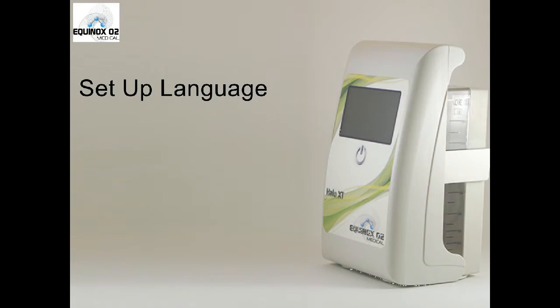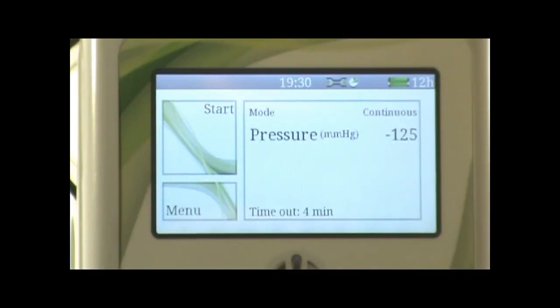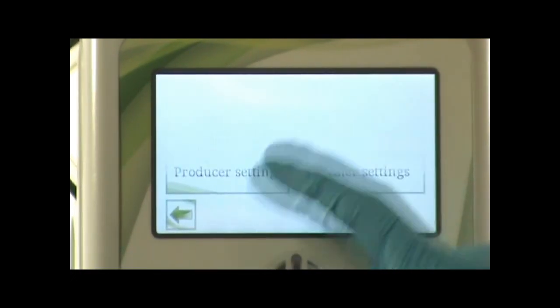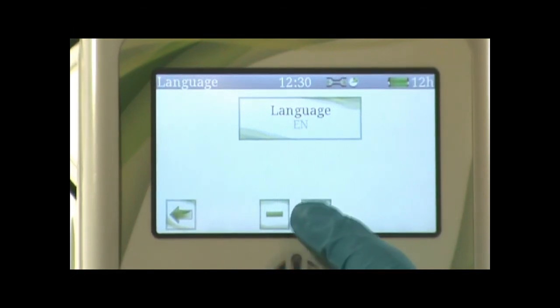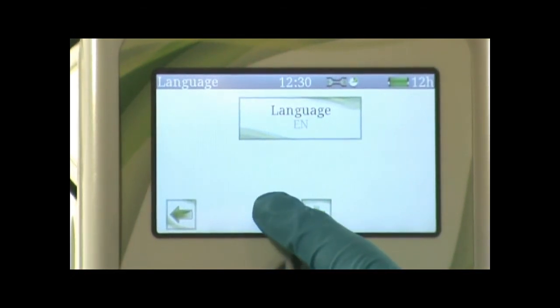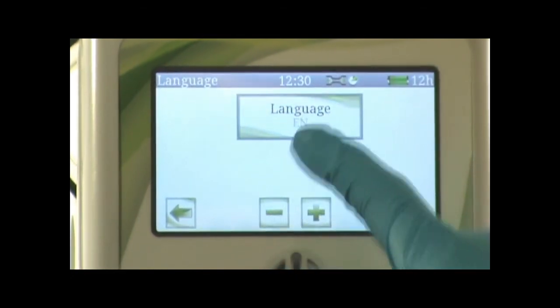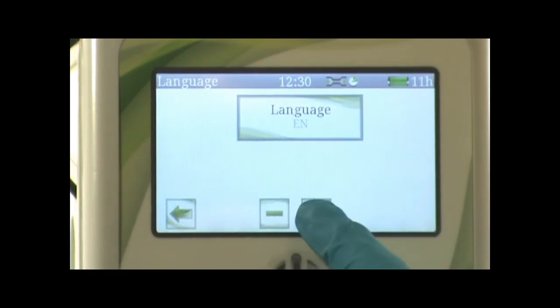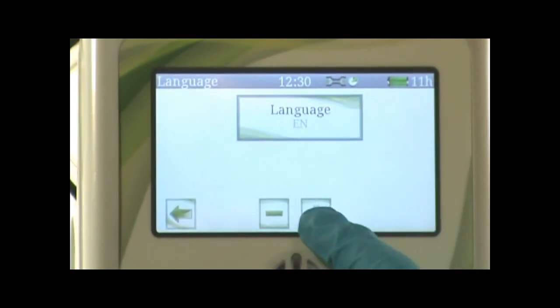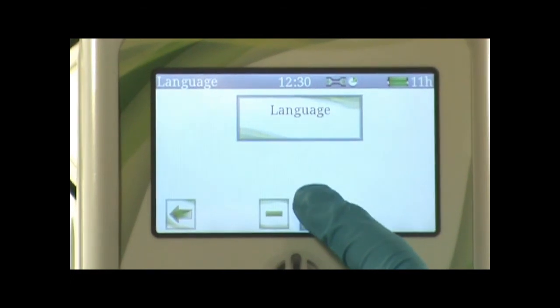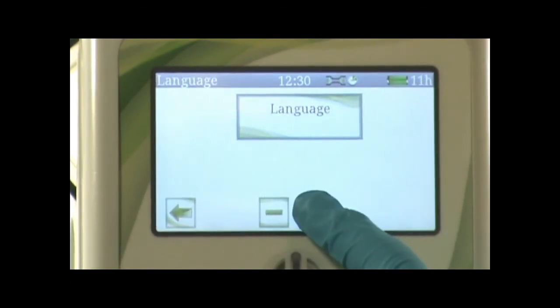To set up languages, press the menu button, then general settings, then languages. You can use the plus and minus buttons to scroll through all the languages available. Choose the appropriate language for your NPWT pump. Once finished, press the back button to return to the main menu.